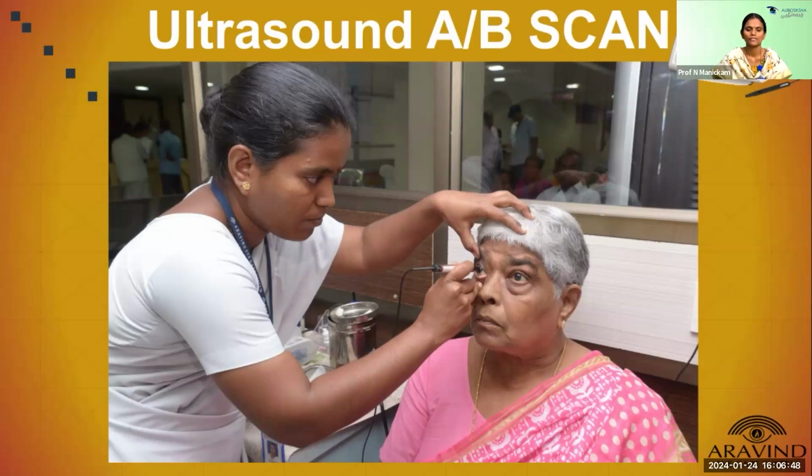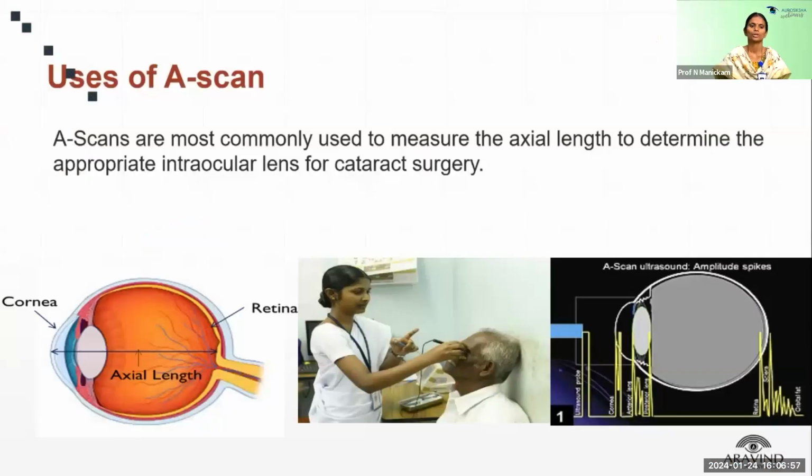First, let us see the A scan machine. Use of A scan: A scan is used to measure the axial length of the eye, which is one of the essential parameters to determine the power of the IOL for cataract surgery.